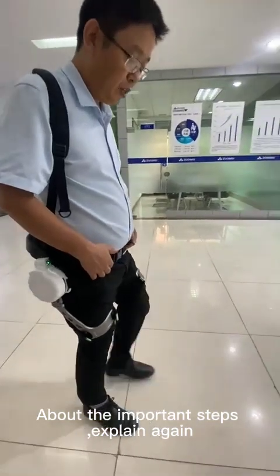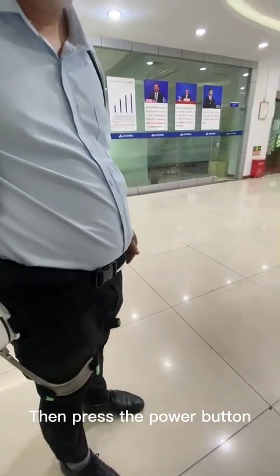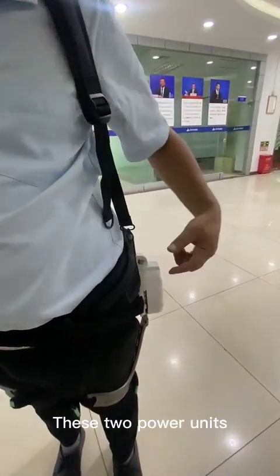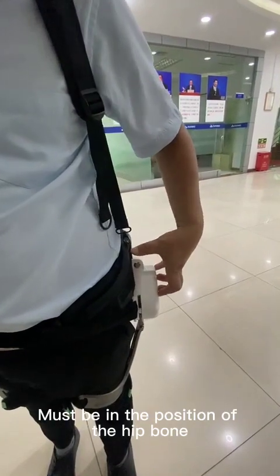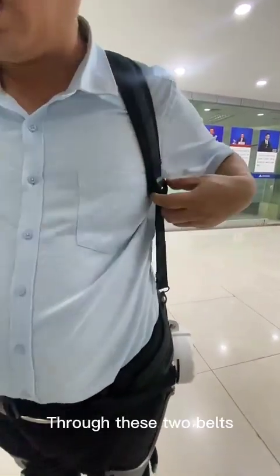Now to explain the important steps again. First, only after we put it on, then press the power button. Second, when we are fully dressed, these two power units must be in the position of the hip bone, then adjust according to height and body size, and tighten these two belts.